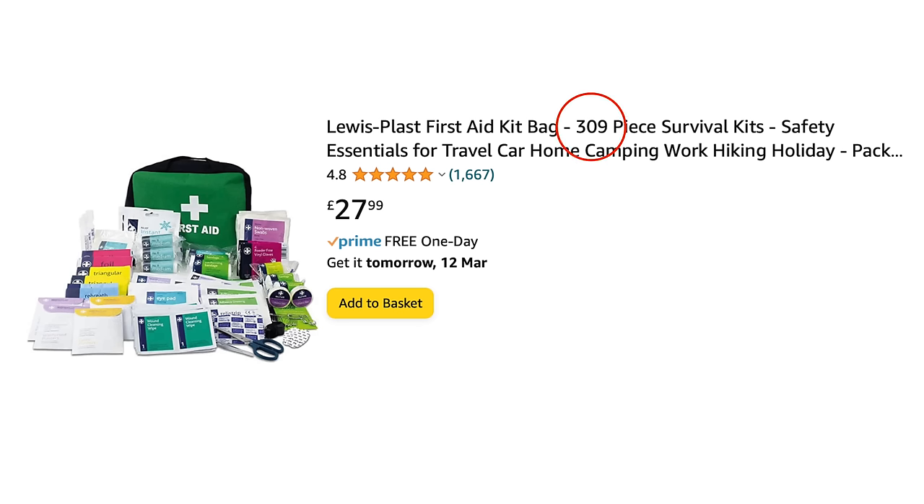First aid kits generally look good value. You seem to get loads of stuff — just look how many pieces they contain, which incidentally seems to be the main marketing message: the number of pieces and the size of the kit. Although that doesn't, it would seem, relate to capability. Most kits that pop up on an Amazon search are actually very limited in what they can deal with. Small cuts and abrasions seem to be the overriding theme.